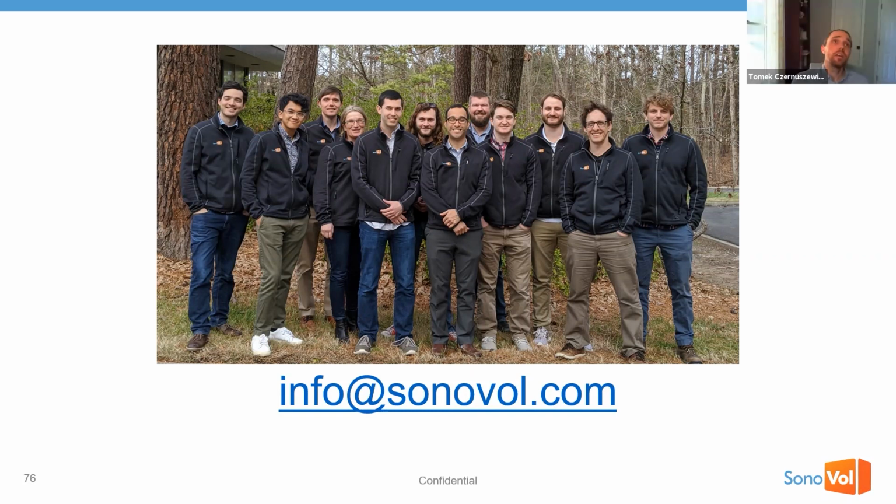Yeah, so I alluded to this when I was talking about the representative images. Right now, the B-mode images are happening fully in 3D, and they're very rapid as the robot is scanning through the volume of the tissue. The shear wave acquisition, the processing time and the data capture, takes a little bit longer. So the current method is to sample the liver.